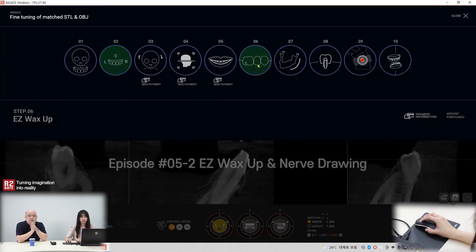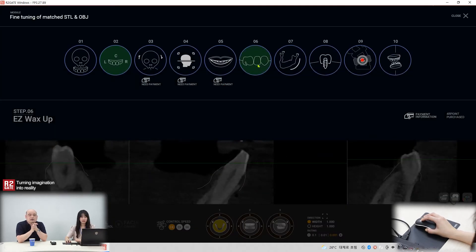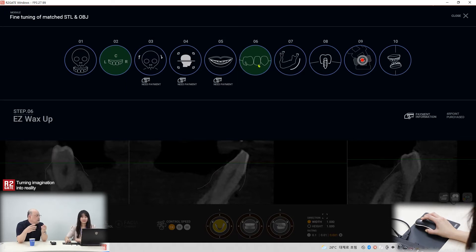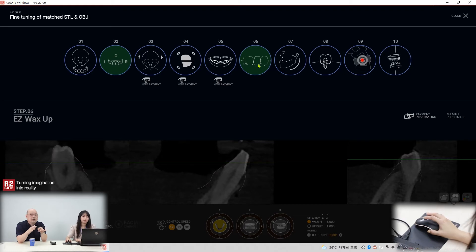Step 6. We did step 1 and step 2, and there is step 3, 4, 5 — the special function. It's for the digital oral design. So for the implant planning, you don't have to use that part.